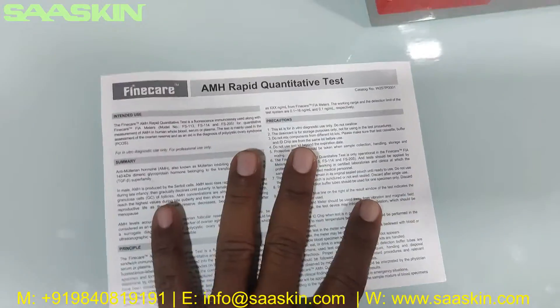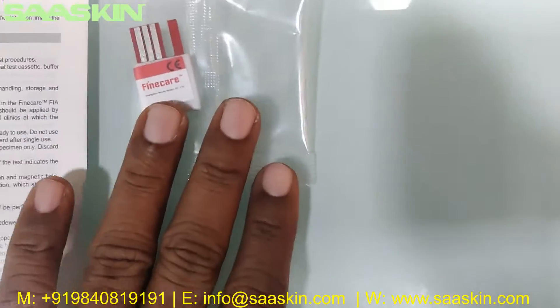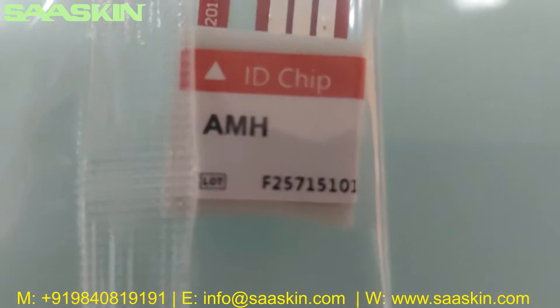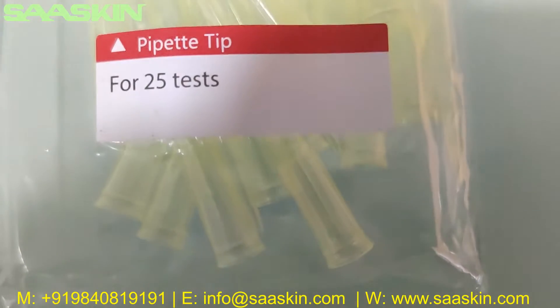Inside you can see there is a single chip, which contains information about the test type and the lot number reference. And then there are the 25 paper tips — you can see all 25 paper tips here in this pack.